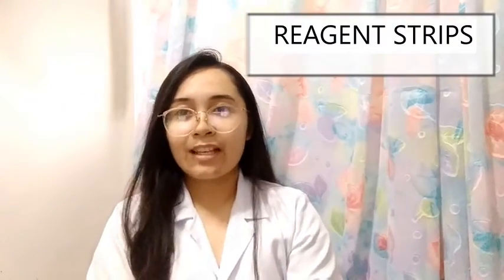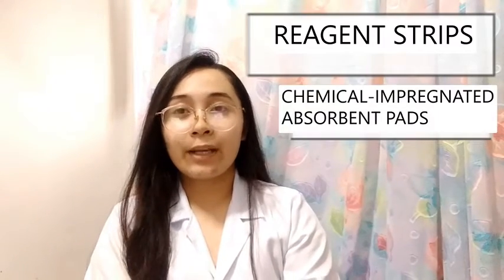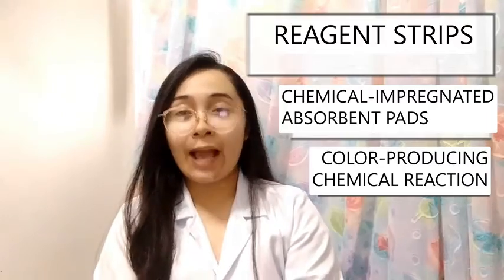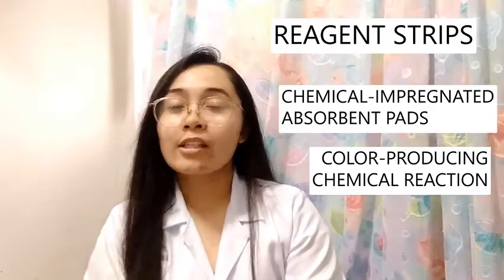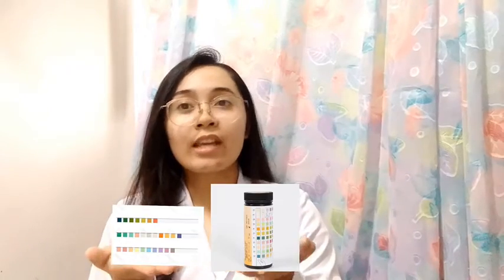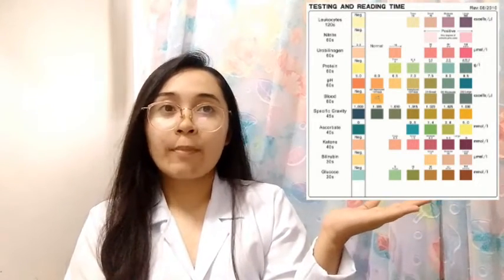Reagent strip pad. These are chemical-impregnated absorbent pads that have a color-producing chemical reaction when in contact with urine. So this is the reagent strips and its container. In the container, it has the chart, and this is shown. This is used for comparing results.